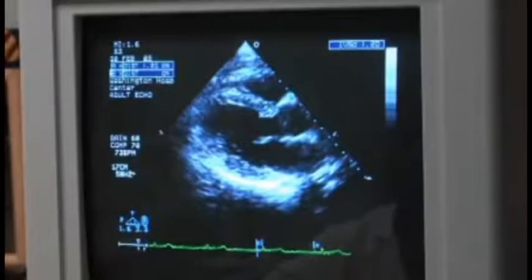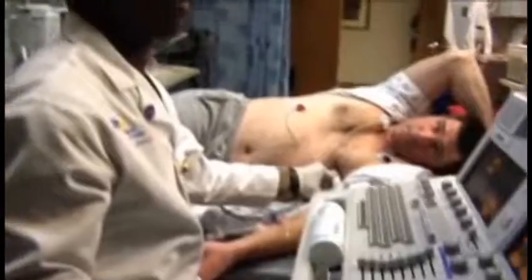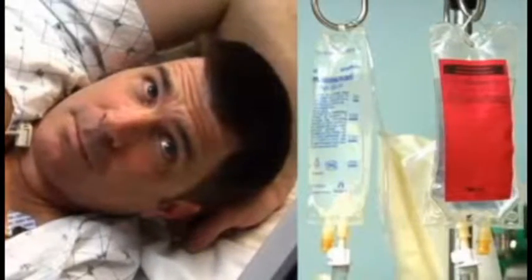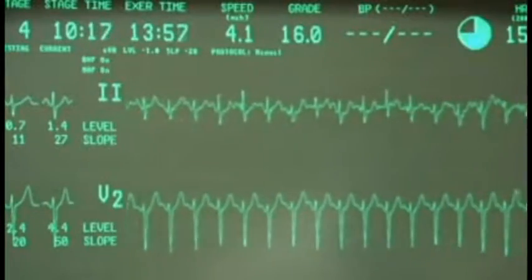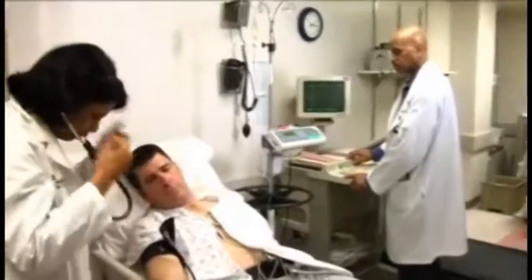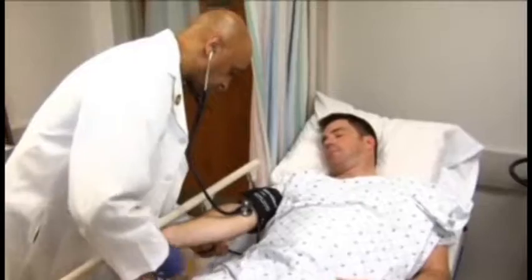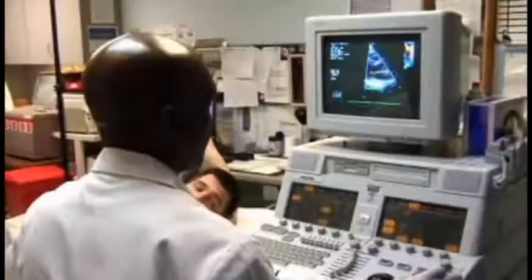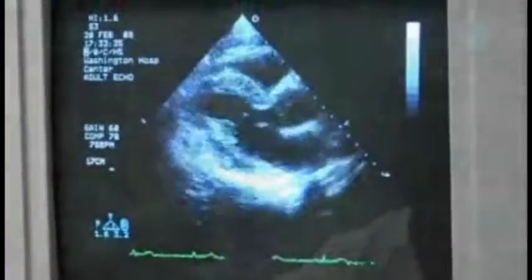The lights will be dimmed to reduce glare so that the sonographer can better see the picture monitor. While you lie still on the examination table, the dobutamine infusion will be started with gradual increases in dose over time. Your electrocardiogram will be monitored continuously and your blood pressure will be checked intermittently. From time to time, you will be asked if you are experiencing any symptoms. Ultrasound pictures will be repeated at every dose level of dobutamine, about every three minutes.